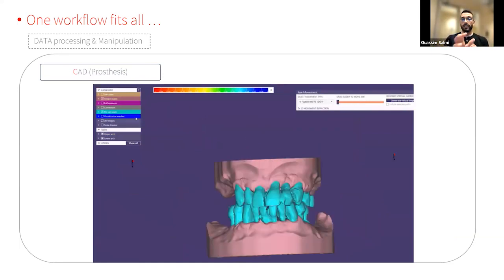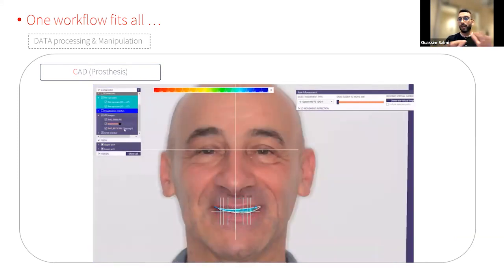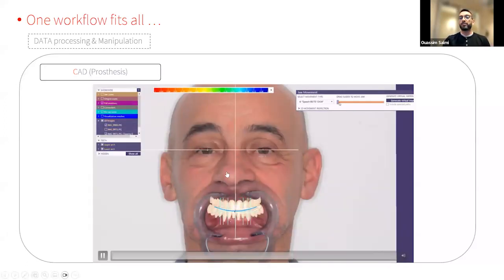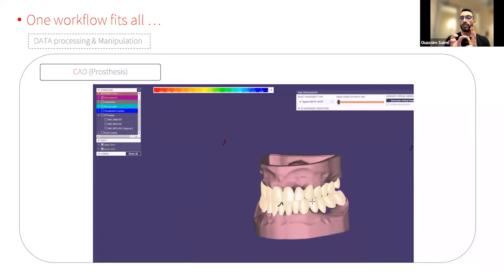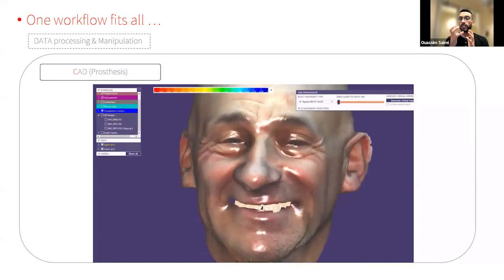Export the XML file, go to a CAD software, virtual extraction of the teeth. This is lab work. It's not a dentist's work, but the lab is working according to the data we gave to him. So here, full arch rehabilitation, upper and lower, guided surgery, implants and everything. You have the static, which is the aesthetic on the upper, and then he designed the lower. But here, what the lab is doing is perfect. He's replaying the movement to adjust static and dynamic.